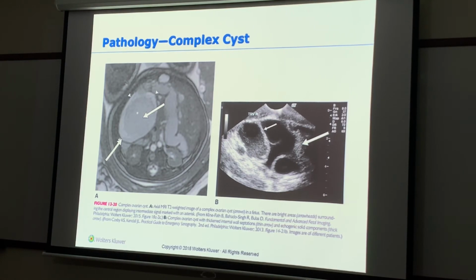From here to here, it's pus. From here to here, it's solid. There's a range that it goes through, and those are called Hounsfield units. So my Hounsfield unit is going to be different for this versus this.